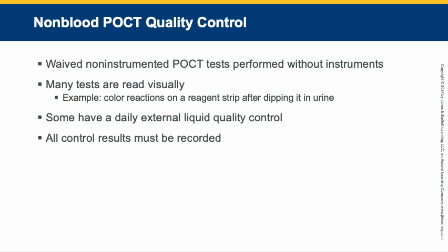You lay it down and you match up the colors with the colors on the bottle, and it tells you what that patient is positive for. So that's the reactions on that reagent strip that I'm talking about.